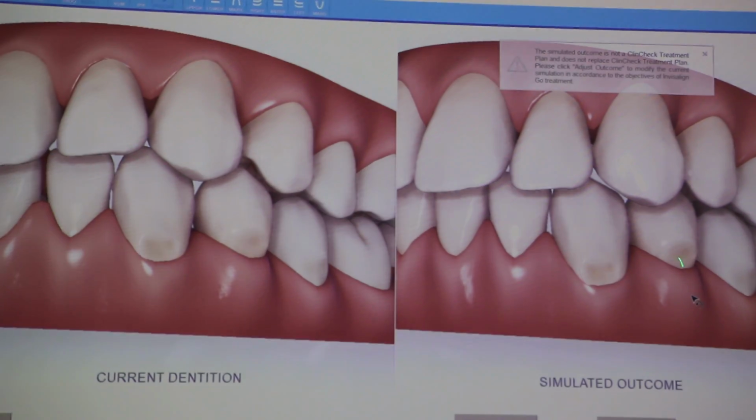And you start showing them these abfractions in live color in a different viewer. They see what's going on, and all of a sudden it doesn't go from, you need to do this. They're asking you, what can we do about it? Like, that looks gnarly, doc, what can you do for me? Then you roll into, because we know what causes abfractions, right? Right? Yes. You talked about it? Then you roll into, look at the angulation your teeth are hitting on, this is why you're getting abfractions. And they're like, then what can we do about it?